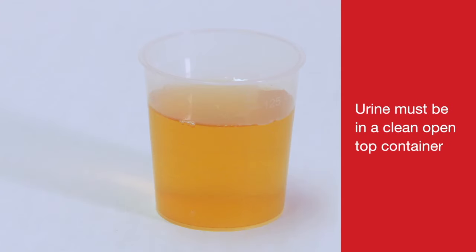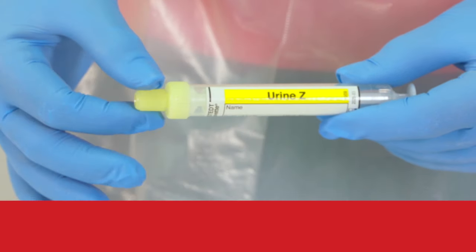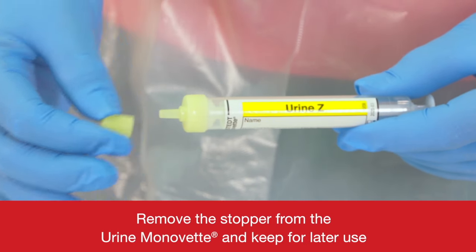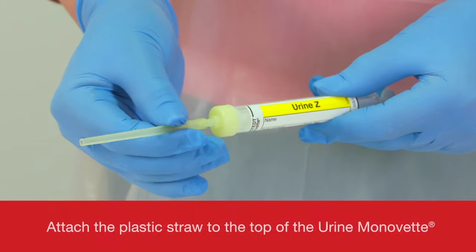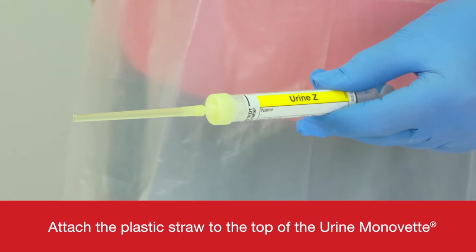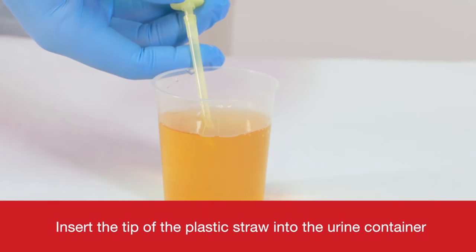Urine must be in a clean open top container. Remove the stopper from the Urine Monovette and keep for later use. Attach the plastic straw to the top of the Urine Monovette. Insert the tip of the plastic straw into the urine container.